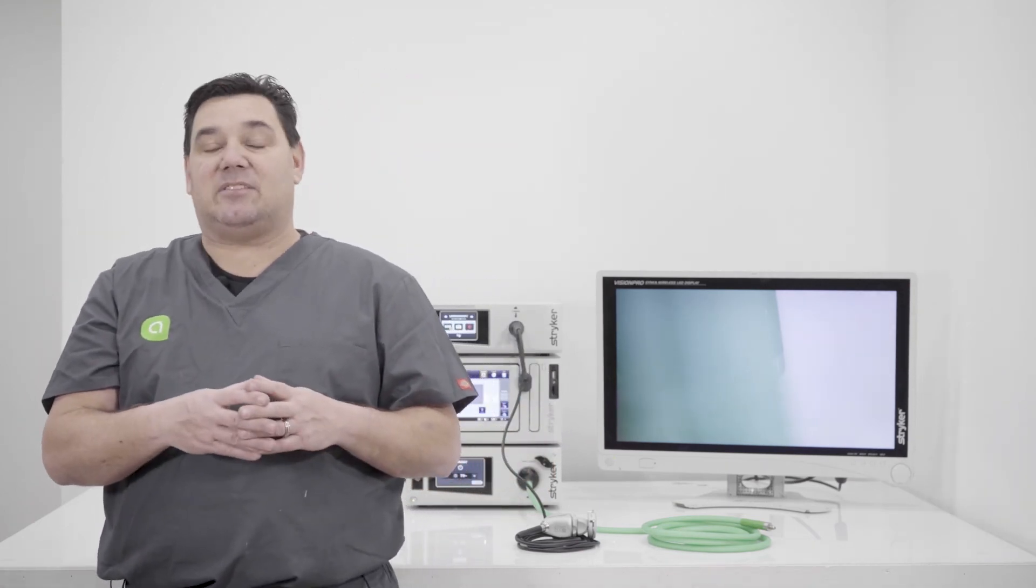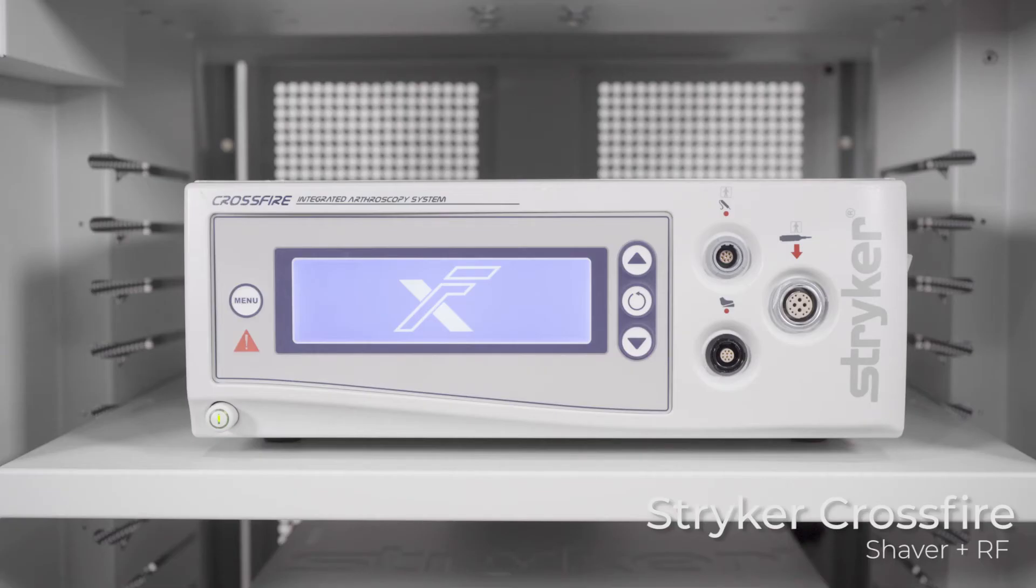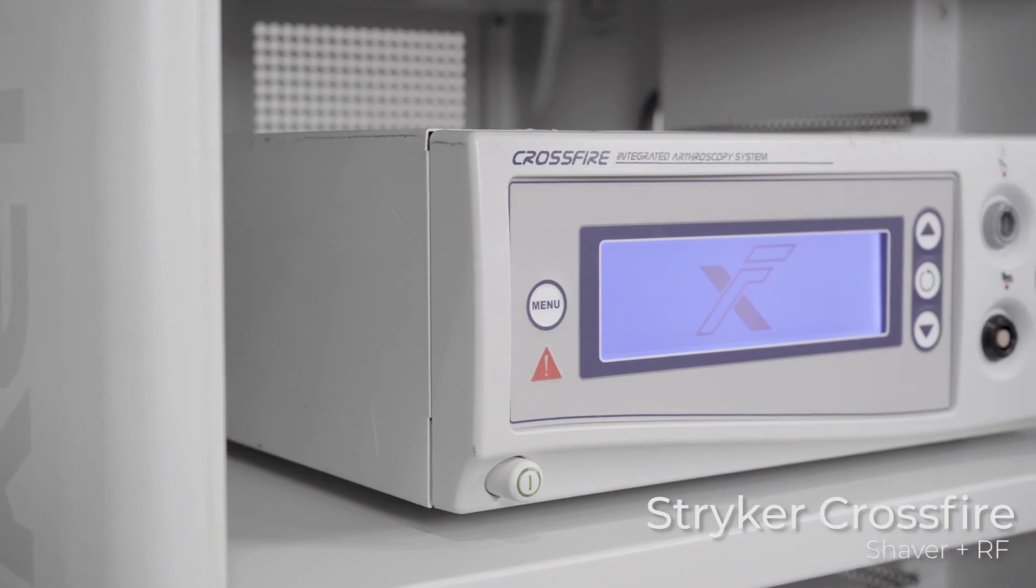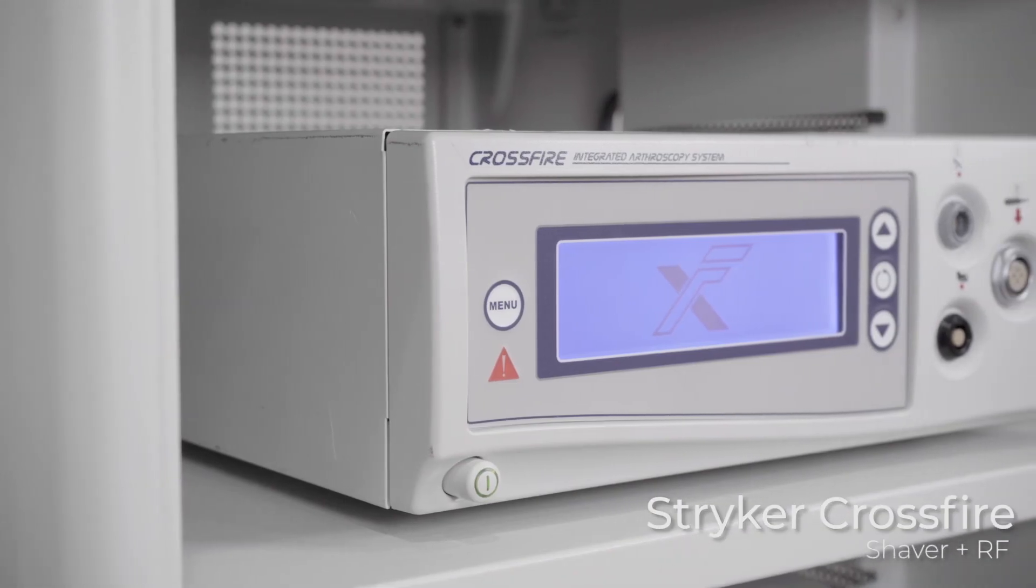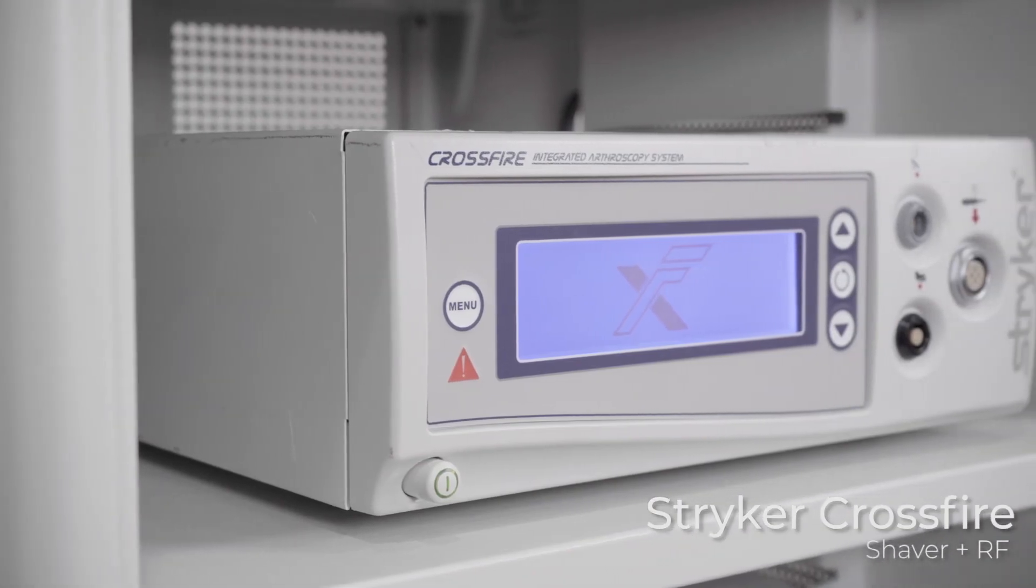So a shaver is what you would need. The other unit that's used in shoulders mostly is going to be an RF or a radio frequency unit. And basically it's there to either ablate tissue or coagulate tissue. That's the job of the RF unit.